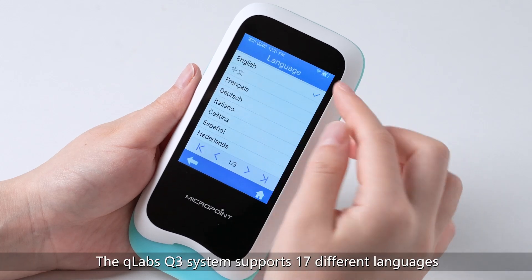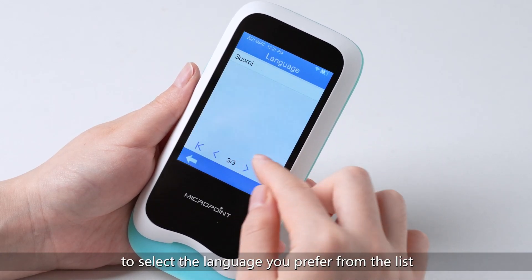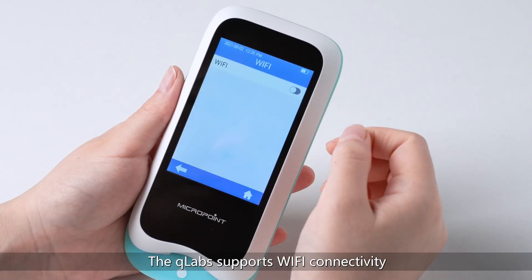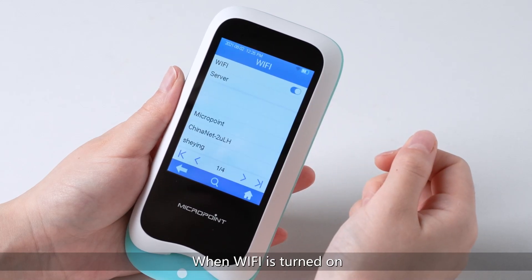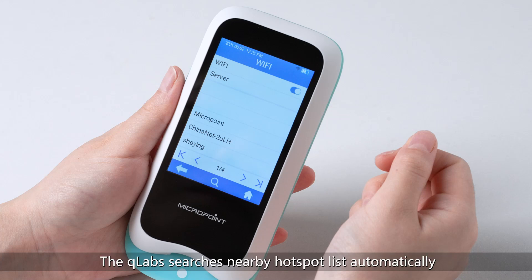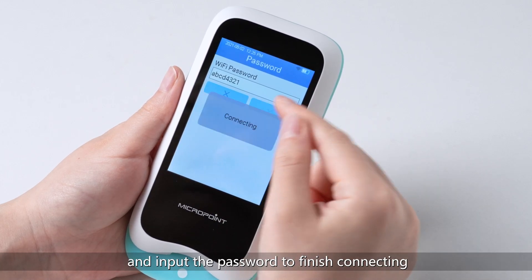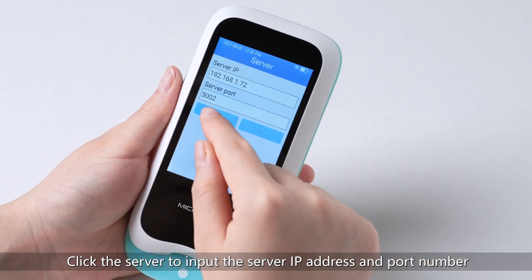The Q-Labs Q3 system supports 17 different languages. Click Language to select the language you prefer from the list. The Q-Labs supports Wi-Fi connectivity. Click Wi-Fi from the Settings menu and click the Wi-Fi button to turn on or off. When Wi-Fi is turned on, the Wi-Fi icon in the upper right corner is highlighted. The Q-Labs searches nearby hotspot list automatically. Click the hotspot name and input the password to finish connecting. Click the server to input the server IP address and port number if necessary.